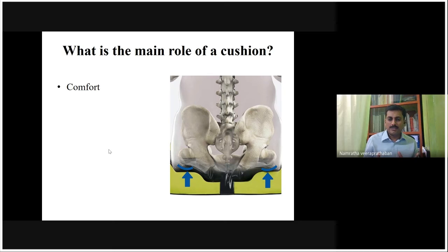How beautifully this pelvis is seated on the cushion. And look at the trochanters here. How beautifully these two are taken care of, the trochanters and the pelvis. I'm talking about the femur and the pelvis.